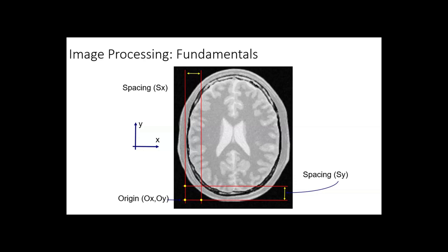But in the medical image, everyone's brain is similar size. Your brain is big, my brain is similar size. So we basically put the brain here, right? And the image resolution is not related to image size. Basically we are reducing the spacing between two voxels.